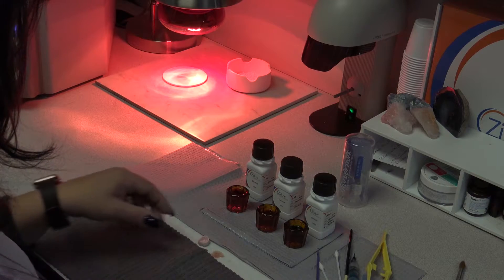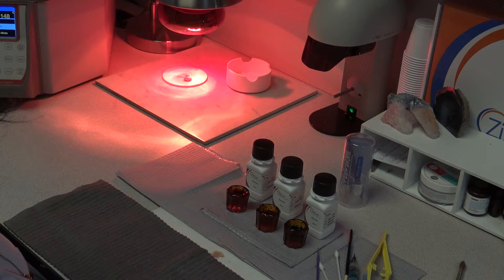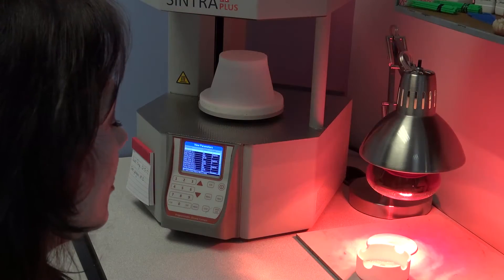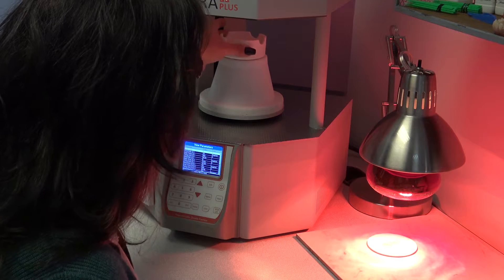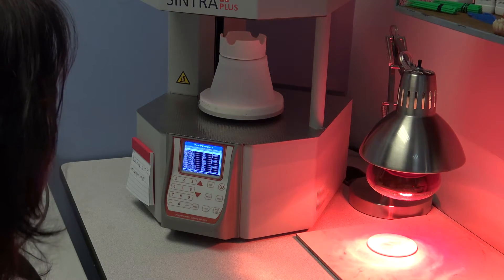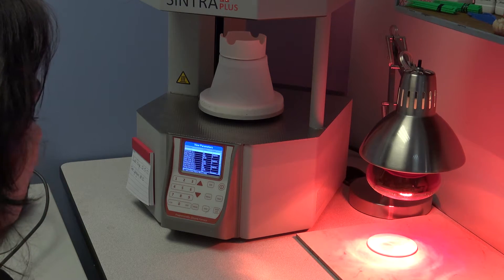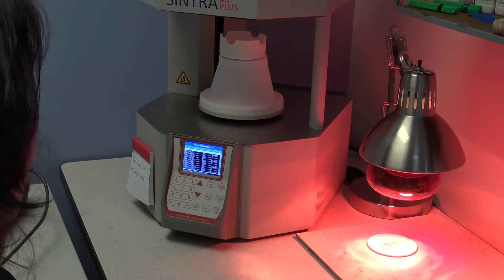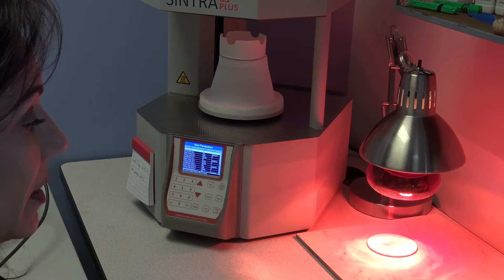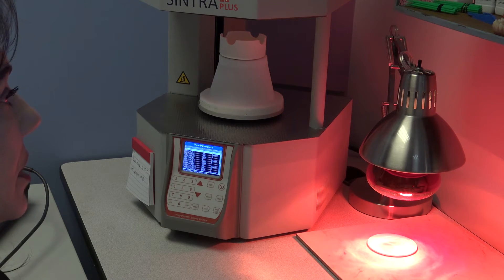The last step before sintering is to put your crown under a heat lamp and dry it for 25 minutes, and then you're ready to sinter. After your crown has dried for at least 25 minutes, put it in your oven. You always want to follow the manufacturer's instructions for use and their sintering cycles. Because of the variances in different ovens, we have found a program that works really great and have had very good success using it. If you find that the IFU is not giving you the desired results, I would recommend trying this program.